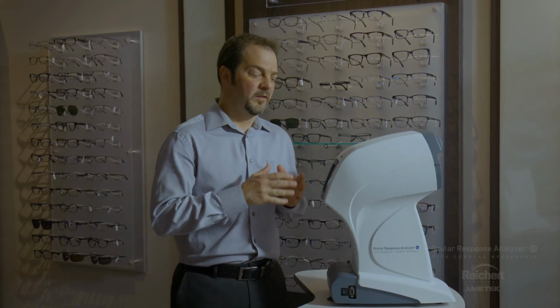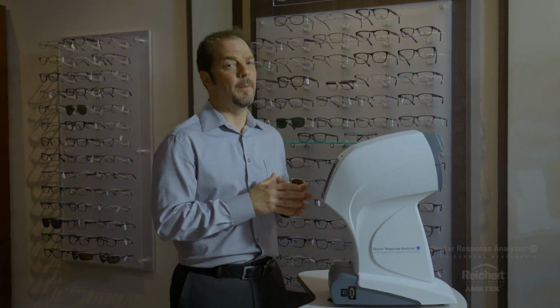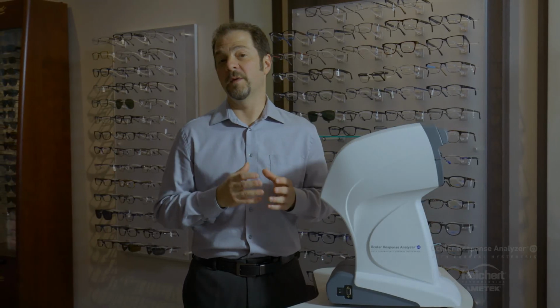First of all, it's important to understand that this measurement happens very rapidly. The measurement is over in 25 milliseconds, and this is at random to the ocular pulse. So every time the heart beats, there's a small pressure change in the eye. On average, that pressure change is about 2.5 millimeters, but in some patients, it's as high as 6 millimeters.